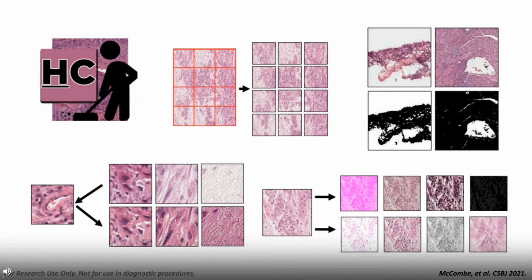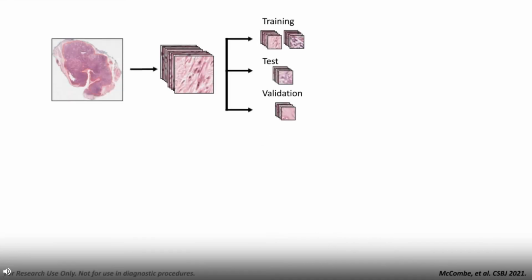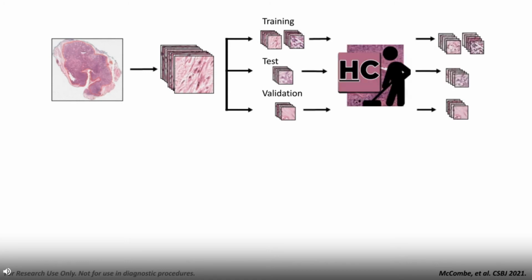So in order to see how beneficial applying these types of augmentations would be in image pre-processing, we took data that is going to be used for our artificial intelligence model and applied the different methods available through HistoClean on the images before developing the model simultaneously.